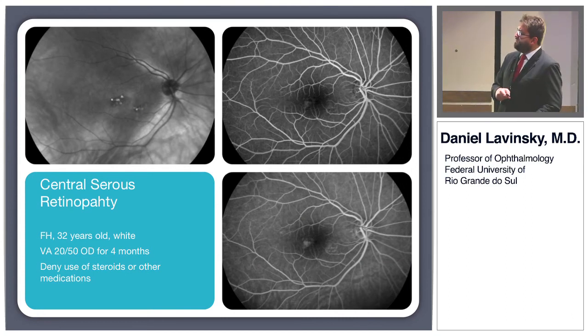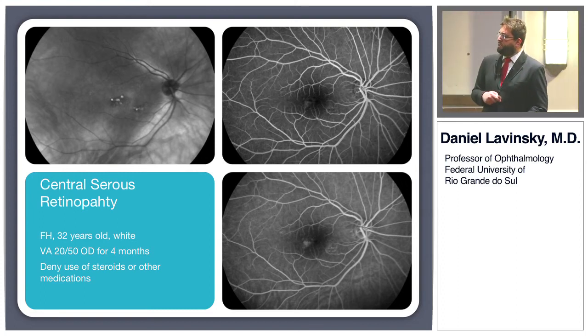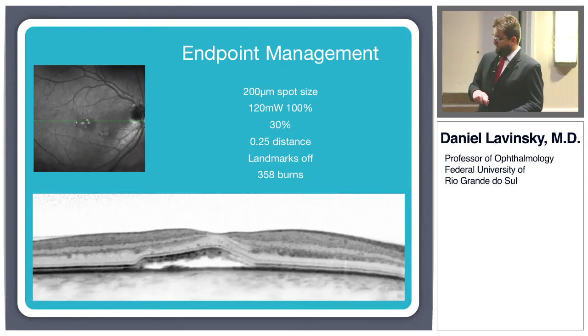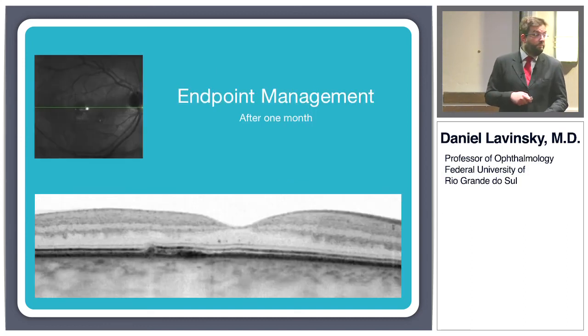So this is a different case. This is a male, 32-year-old, white, 20/50. Again, very close to the fovea. So we could only treat this with either PDT, micropulse, and now with endpoint management. So this is the fluid, the subretinal fluid. Again, after 1 month, a very good result.